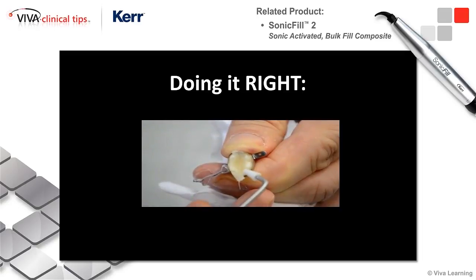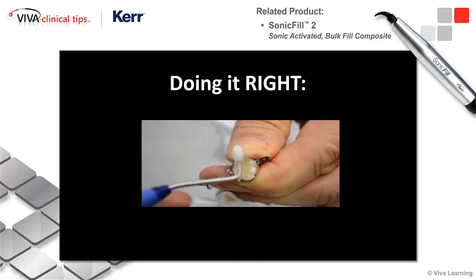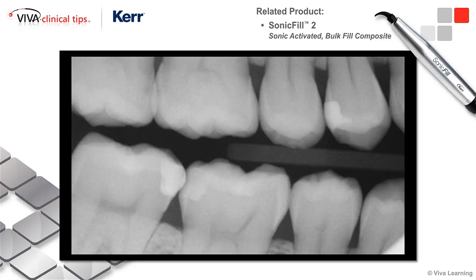And it works great. And again, if you take off too much, you want to put a little bit more in, that's fine. Put the composite right back in there. Put the handpiece in there. And it will liquefy and you can put a little bit more on. And here's what it should look like in the end. Now, I can show you voids after voids after voids of flowable restorations that I see in the mouth. And this is what I typically see with my SonicFill restorations.